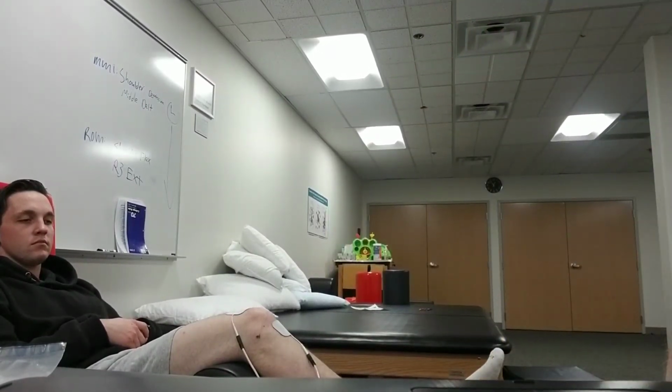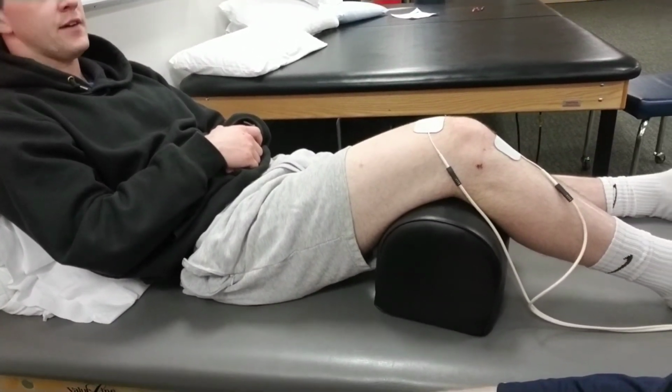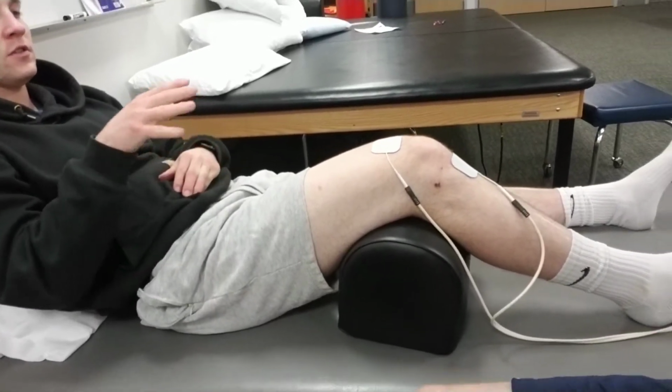We'll go for at least 30 seconds. All right. We have been going for 30 seconds here. All right, Tyrone, how is your knee feeling? It's feeling a lot better. Yeah? Pain's gone down, yeah. Okay, awesome. How's your comfort level been? How's the tingling feeling? Yeah, it was good. Never really got in that painful area. It's always just a nice little tingle.